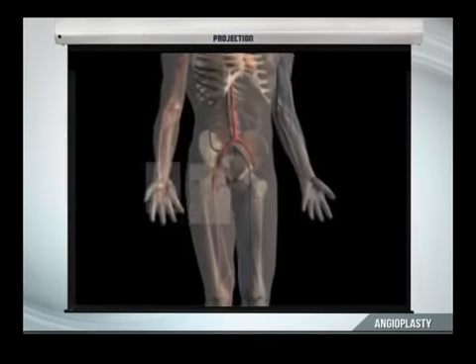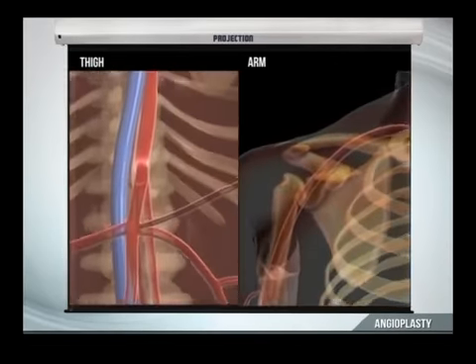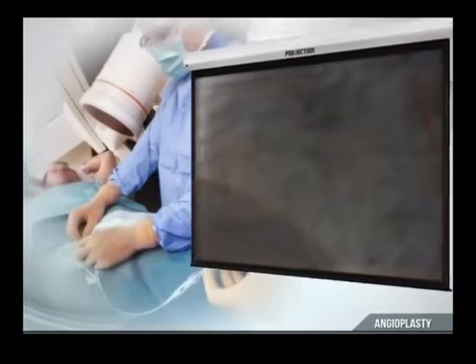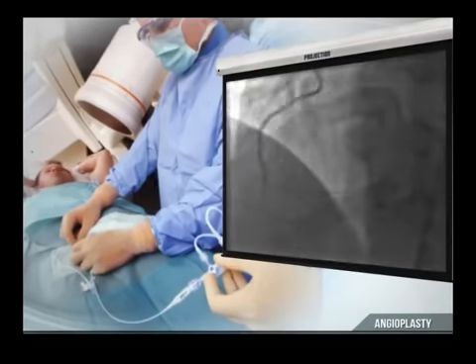During an angiography, a flexible tube called a catheter is inserted through the blood vessel of the thigh or the arm towards the blocked segment of the heart artery. A dye is injected through the catheter so that X-ray images of the heart's blood vessels can be obtained.